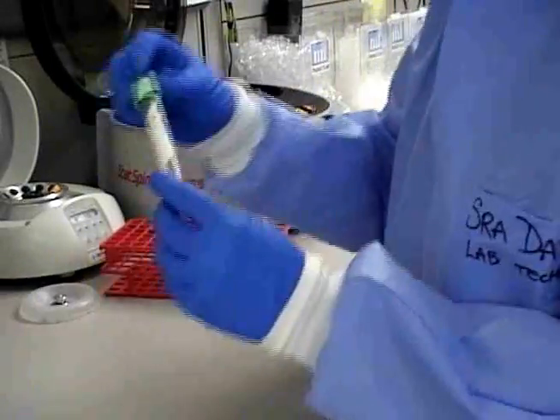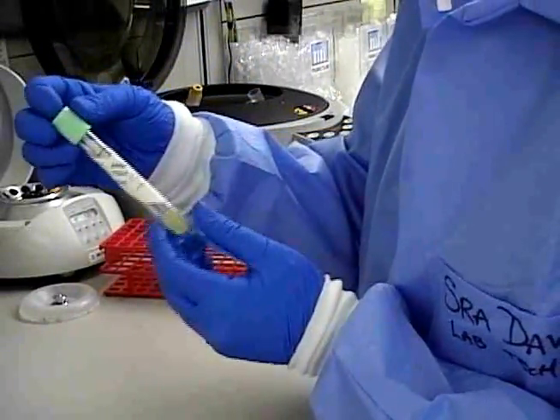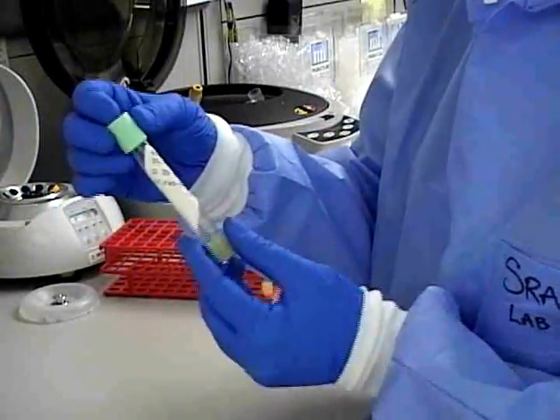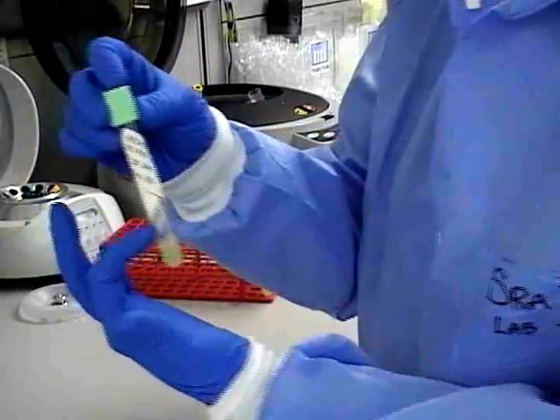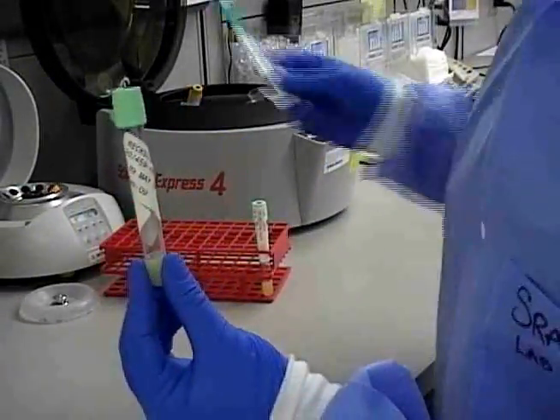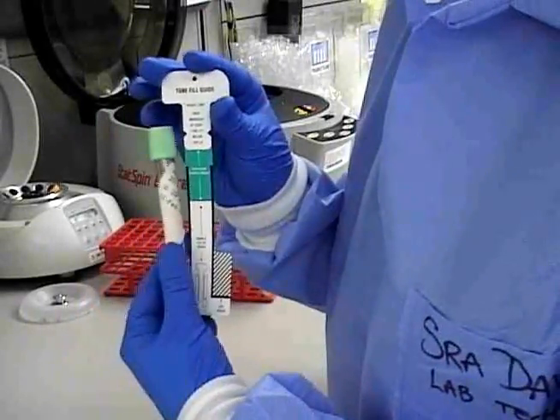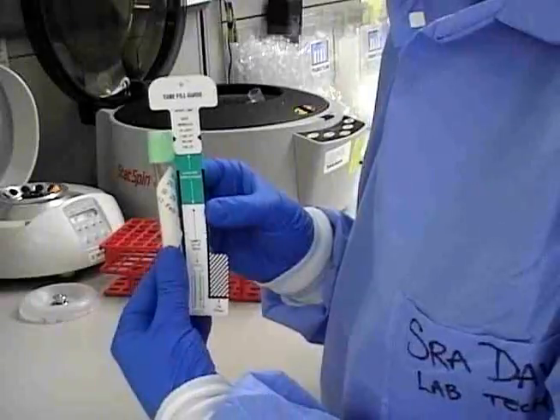Another way we receive tubes is this nice little twirly pattern. It has all the correct information on it. However, it prevents us from seeing exactly how much blood is in the tube. Now we need to know that because our instruments have a minimum fill line. With this minimum fill line, if the sample volume is not at the correct area, it can cause a delay in testing, and no one likes a delay in testing.